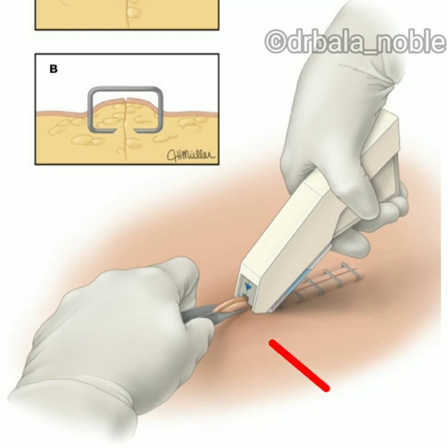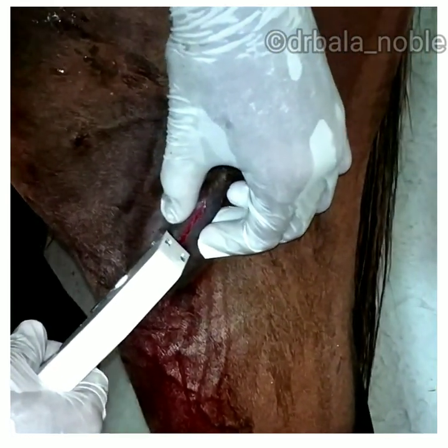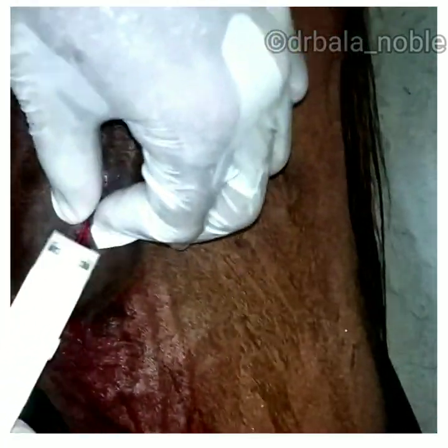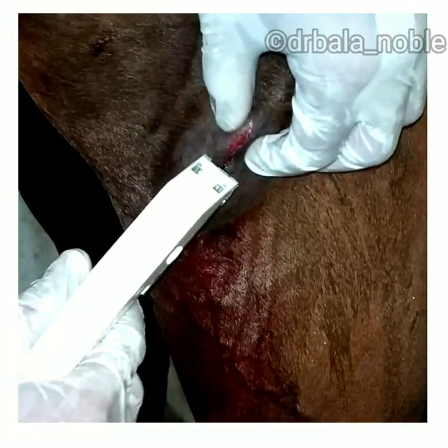After application, the pin will hold the wound margin like this. This wound is in a horse's leg and the wound is infiltrated with local anesthetic. The first pin didn't hold properly — hold the skin edges very closely and apply the staples.